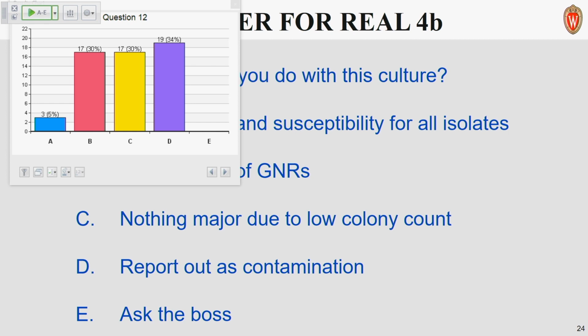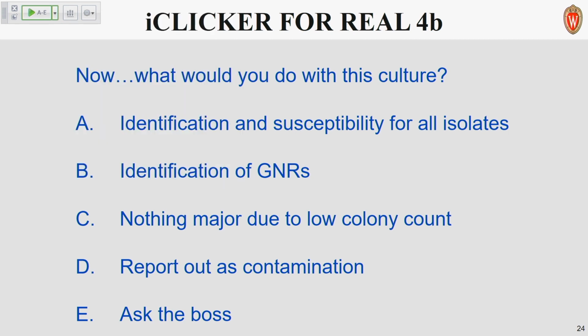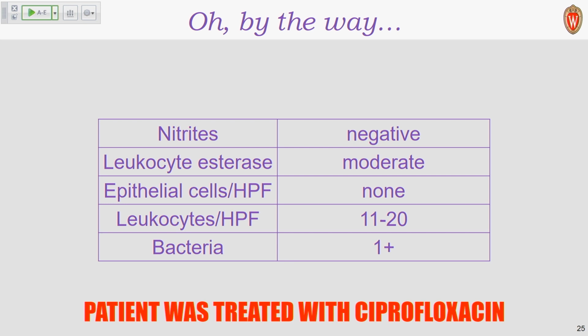We have a comment that we put into ours when we have about this many gram-negative rods. It's just to notify us if they want it worked up. Otherwise, we don't do anything, unless it's E. coli, we'll rapid ID those sometimes. Thank you. And just as a side note, this patient was treated with ciprofloxacin. Even if we didn't work it up, they were treated as a UTI with Cipro.